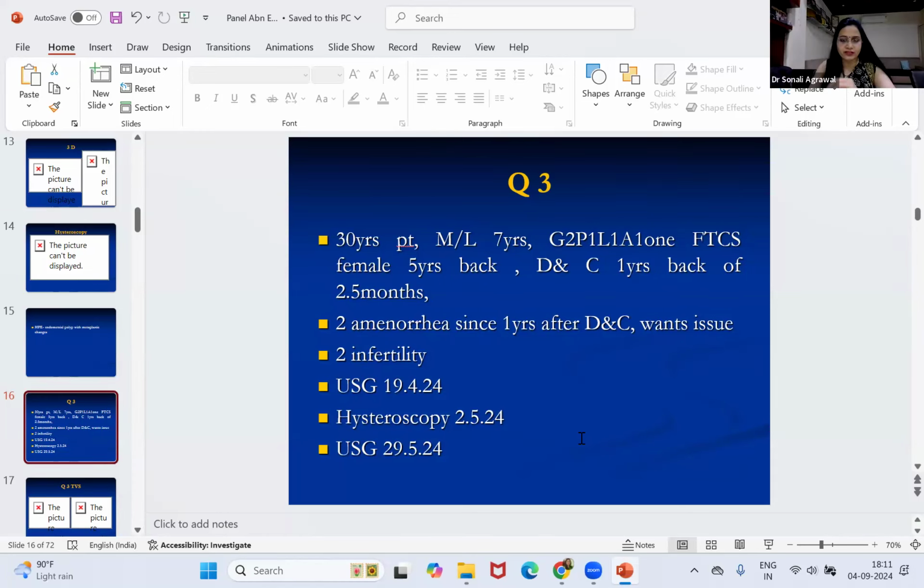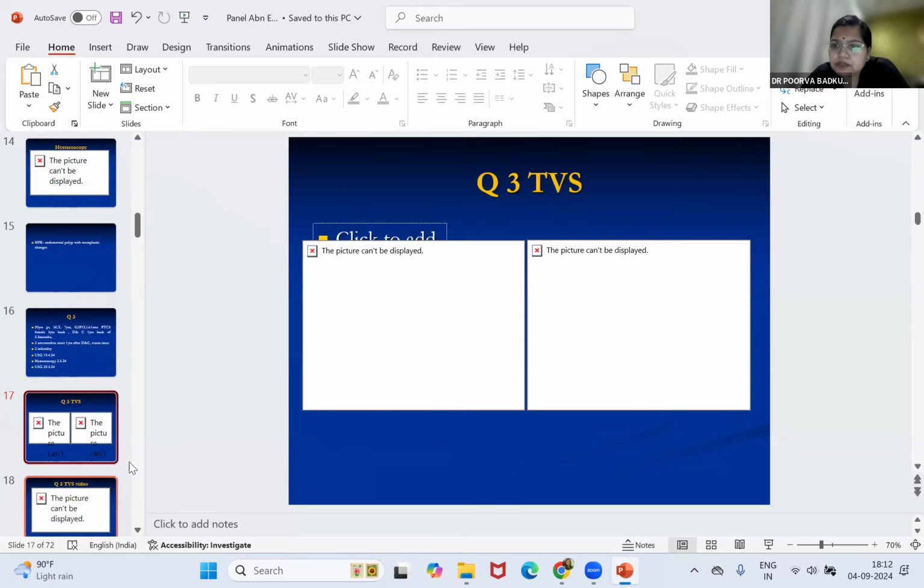Exactly the point: in hysteroscopy you are looking and then taking a sample. Sometimes in a growth there is sloughing or a very superficial necrosed part, and if by chance you do a blind DNC and take that sample, it won't show anything. So it is better to take a biopsy under vision.